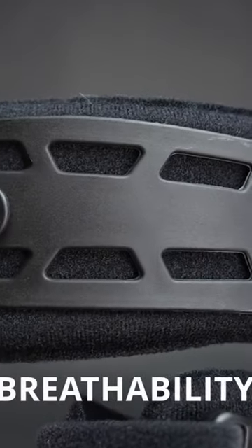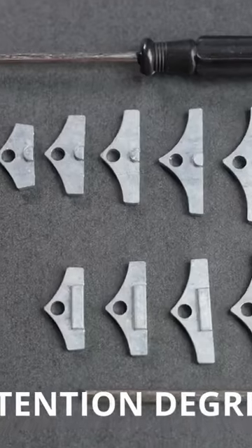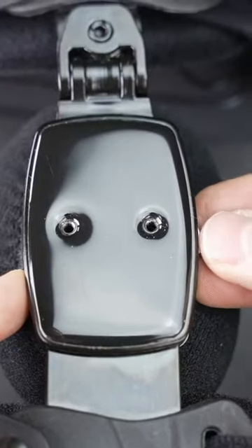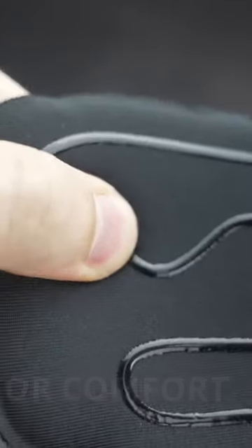It has a very nice vented design for breathability. It also comes with flexion and extension degrees with stops for more adjustments. It has very soft pads for extreme comfort and to prevent slipping.